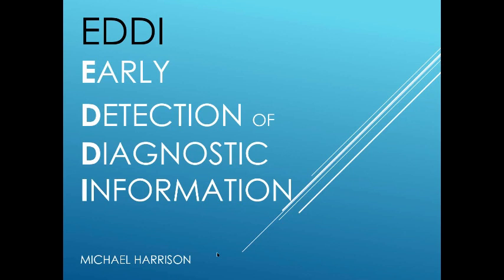The software I'm about to describe is designed to collect physiological data from a standard anaesthetic monitor, recognize patterns in the data, and suggest diagnoses. In publications over the years that have assessed some of the modules, the name of the software has changed. Initially, it was EBMI, Evidence-Based Monitoring, Interactive. It is now EDDI, Early Detection Diagnostic Information.